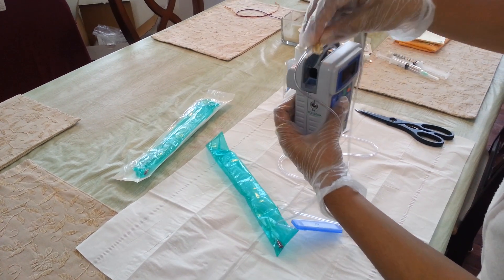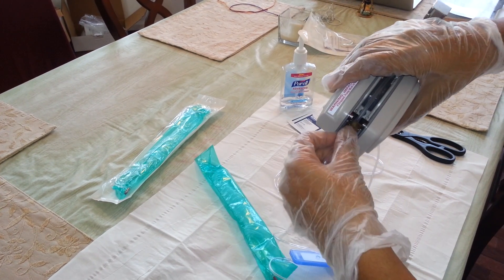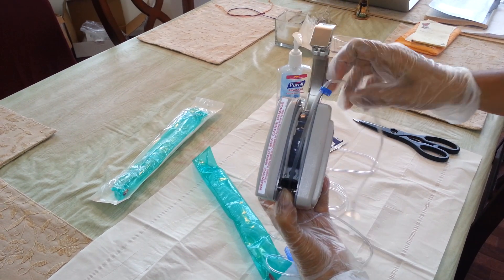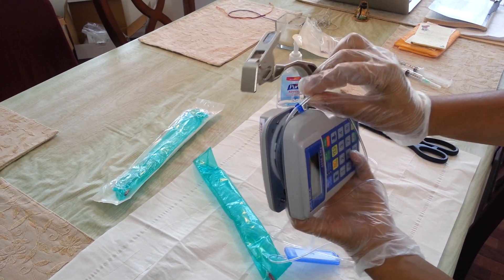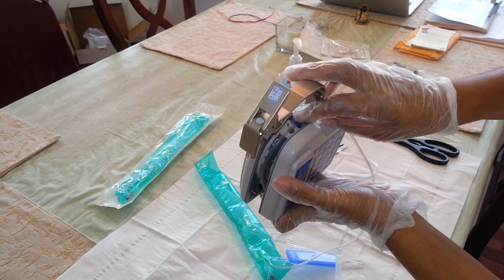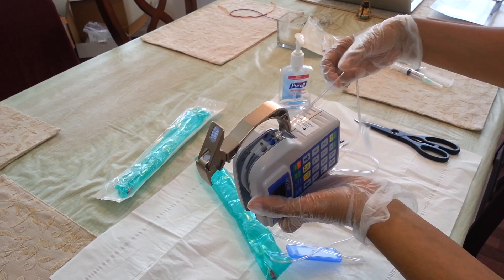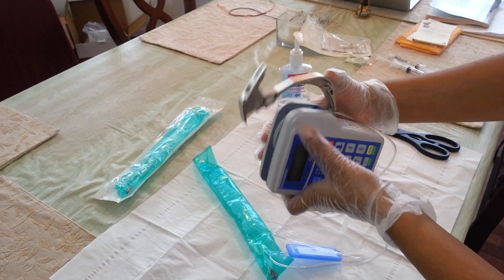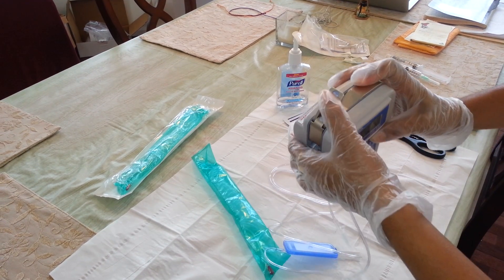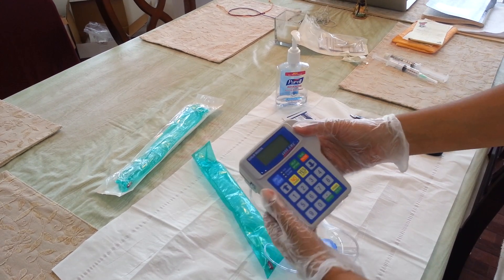The yellow side will go where I showed you the yellow arrow — it sits in really easily. The tubing rotates over the pump and then the blue side goes into the slit under the blue arrow. The remaining tubing goes from underneath the latch and outside. Once this is done, I am going to press the latch and press from where it says 'lift to open.' This secures the tubing in place.